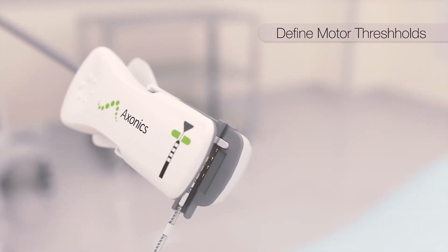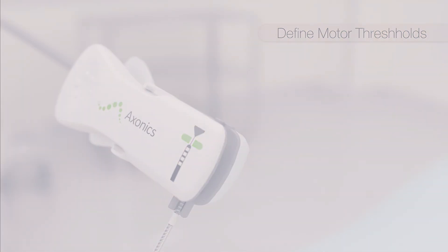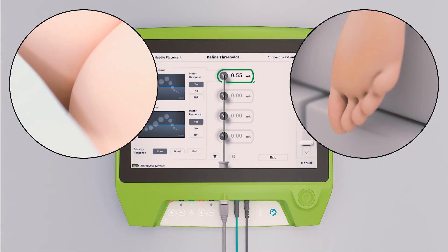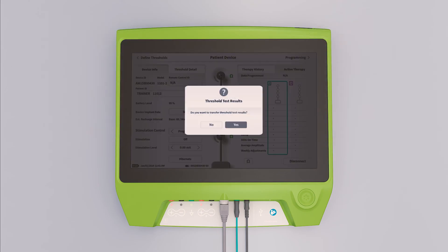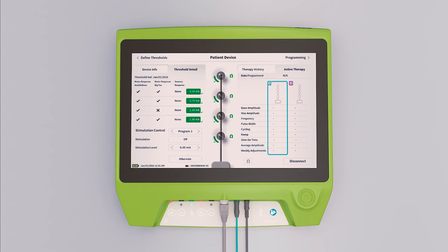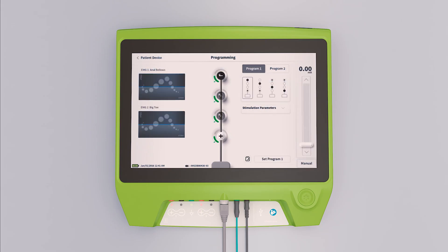Finally, each electrode is tested again. The goal is to define and record the motor response on all four electrodes at the lowest amplitude. This information will be saved to the stimulator and used to create a patient-specific programming algorithm.